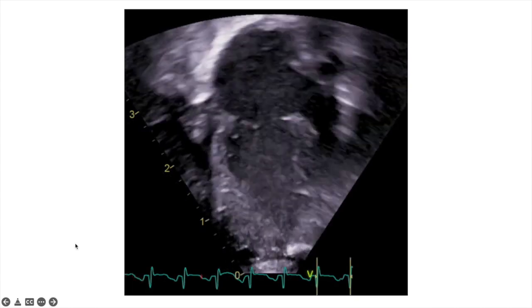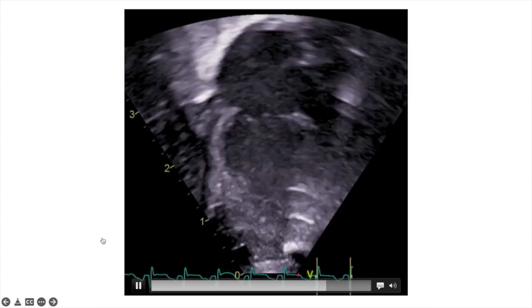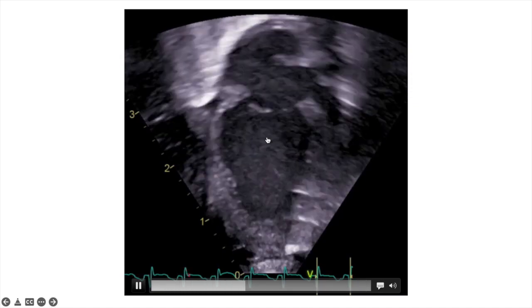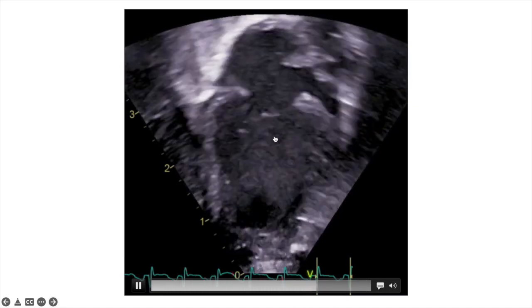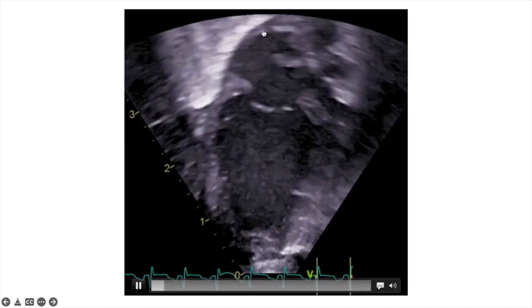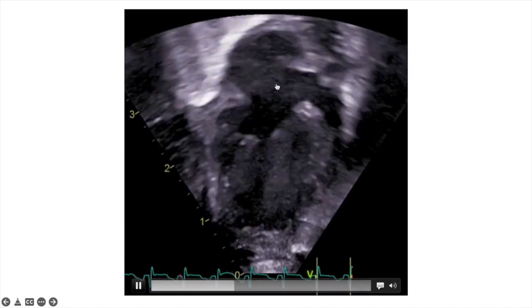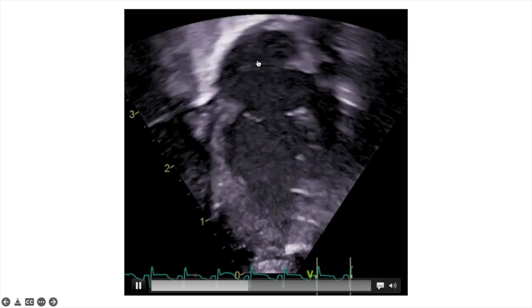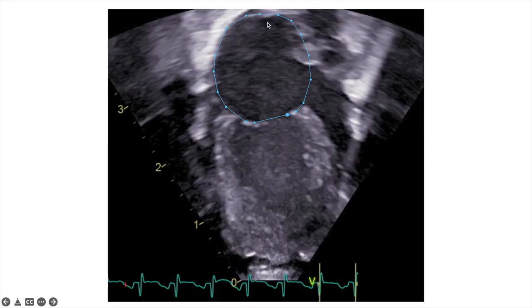This is the second view we need — the apical two-chamber view — showing the left ventricle on the bottom and the left atrium on the top. Similarly, we stop the clip and trace the left atrium to get its area before the mitral valve opens.